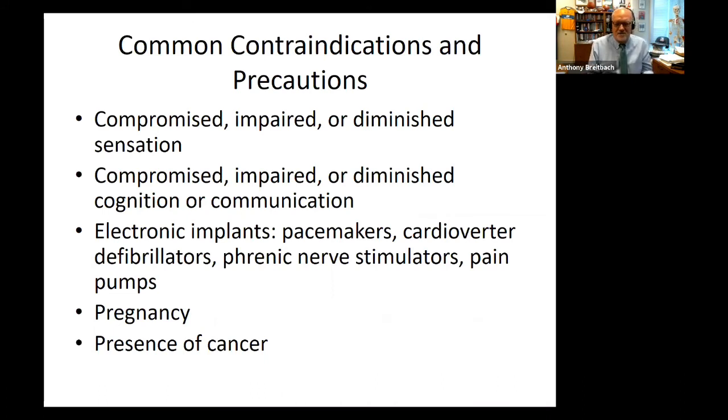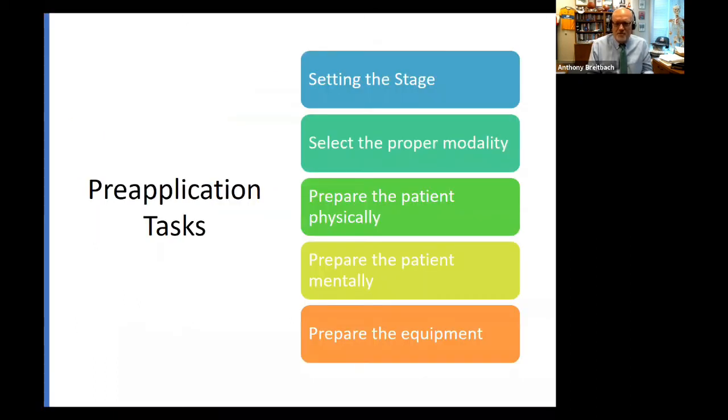Probably not. So we want to know that that's going on. The pre-application stage has a bunch of different types of tasks: setting the stage, selecting the proper modality, preparing the patient physically, preparing the patient mentally, and preparing the equipment.